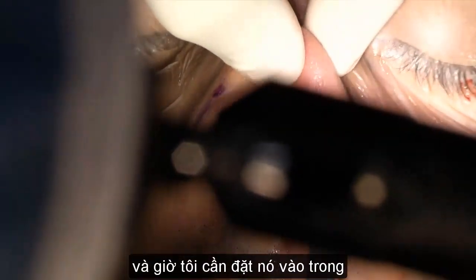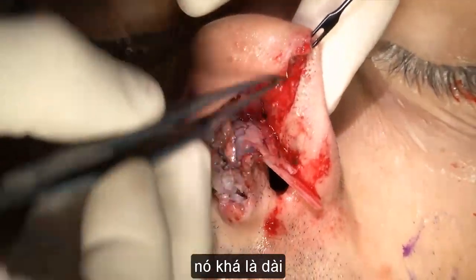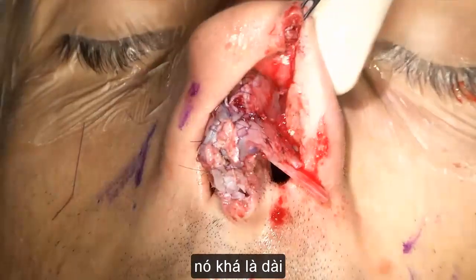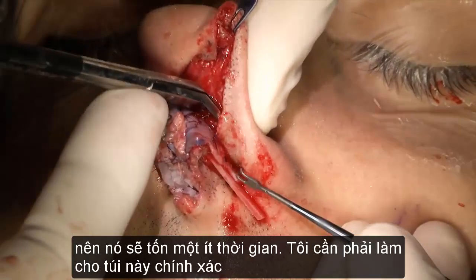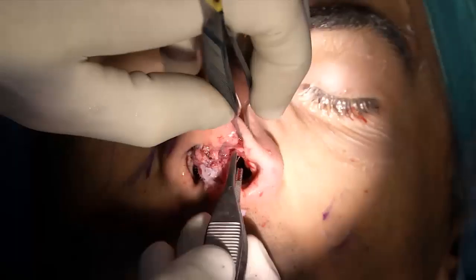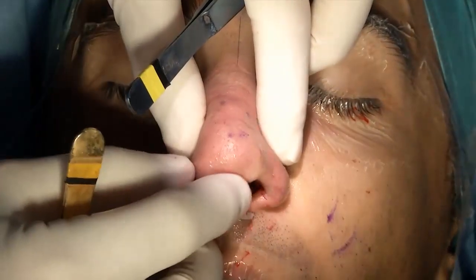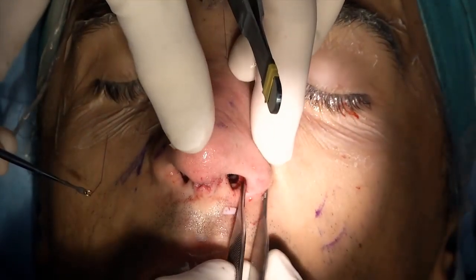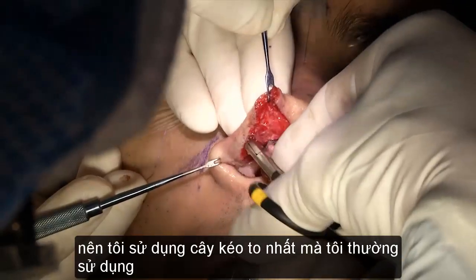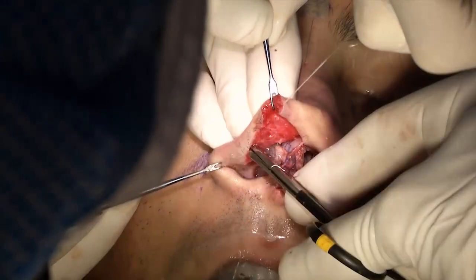Now I need to get this thing in. It's actually too long. So bear with me a minute. I just have to get this pocket correct. So I'm using bigger scissors than I would usually use.